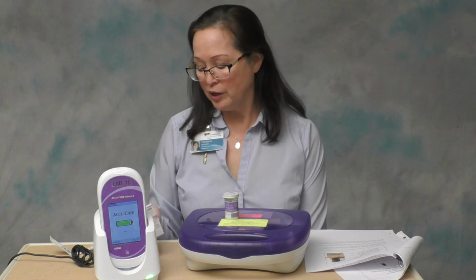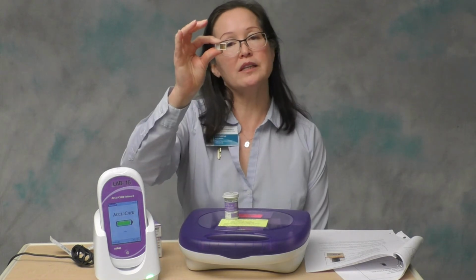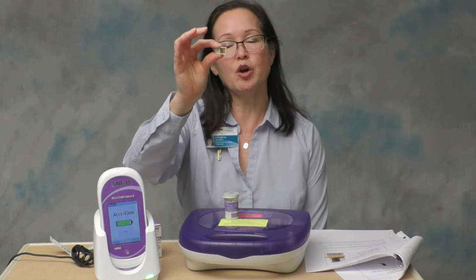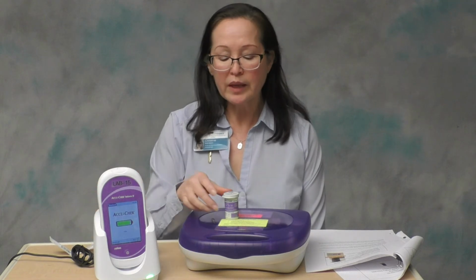When you open a brand new box, there'll be a little code key chip that looks like this, similar to what people put in their home meters. You can just throw this away because we code all of the information in through the software.